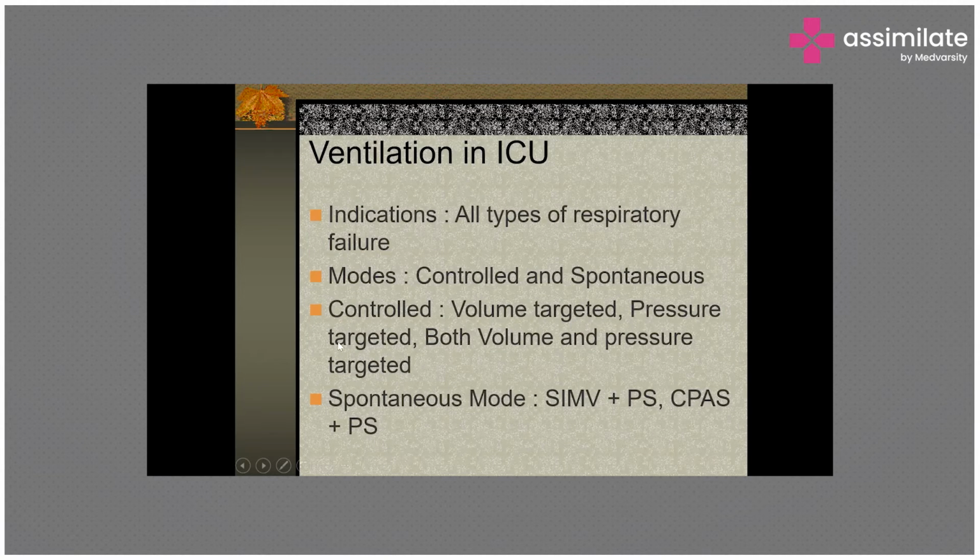Pressure targeted ventilation is where the pressure is kept constant and the volume will keep changing. Pressure control ventilation will be good if the patient is in cardiogenic shock, or any patient with fluid overload. But whatever the mode of ventilation may be, unless we judiciously monitor the different parameters that I'm going to talk about on my subsequent slide, any mode of ventilation is good enough.